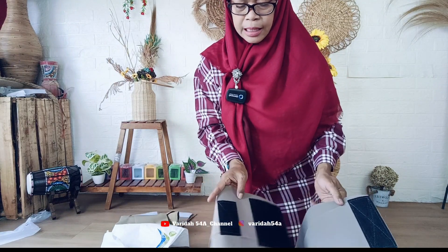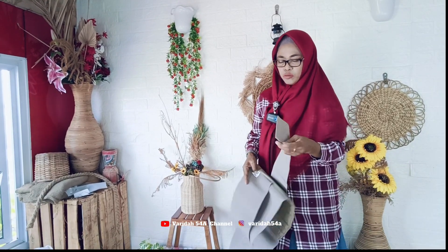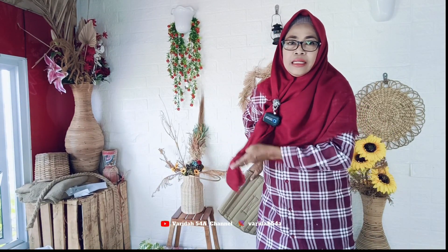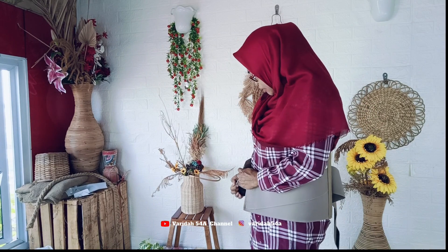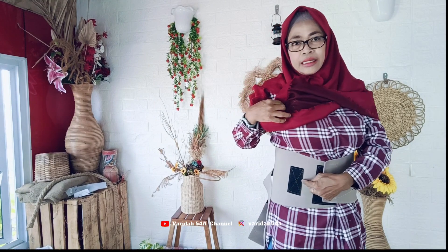Ada perekatnya dua. Kalau tidak cukup, bisa dipakai yang ini atau yang itu ya. Di luarnya juga ada untuk menambah kekuatan. Enak sekali, merek Stella ini saya sudah membuktikannya. Cara pakainya, kalau di rumah bisa pakainya di luar baju. Ini ada perekatnya, micro XL. Jadi pas, kalau yang kecil lagi bisa di sini.